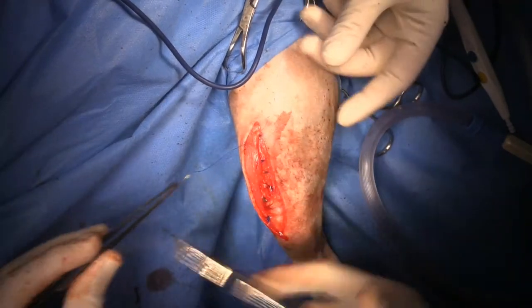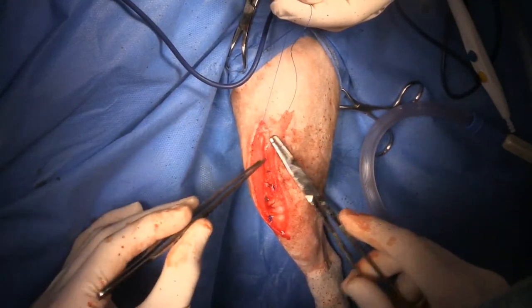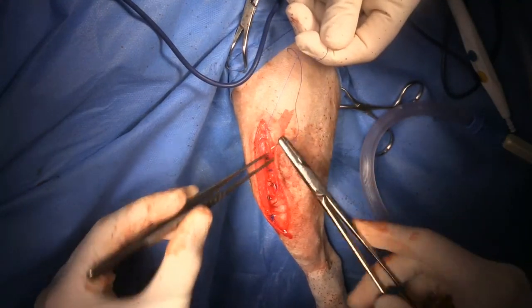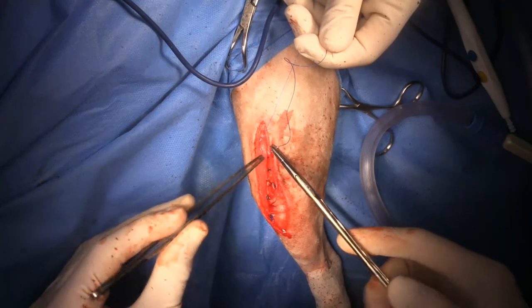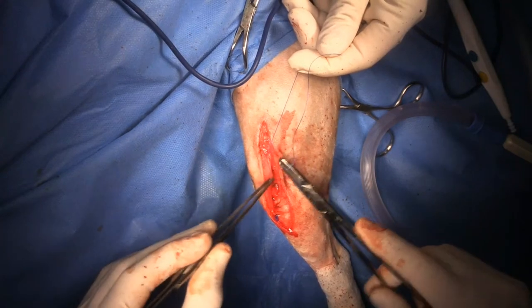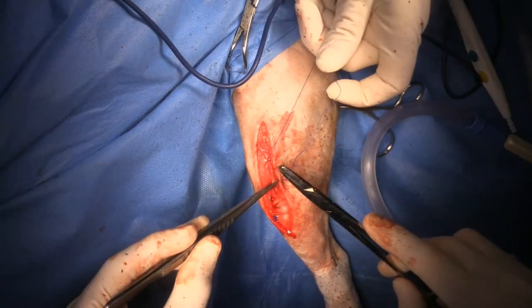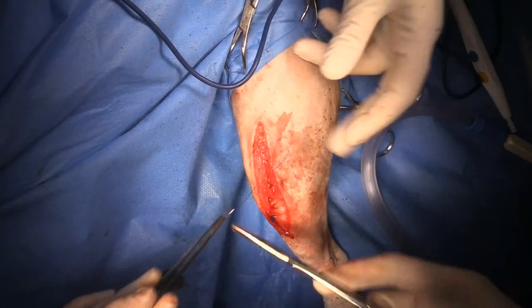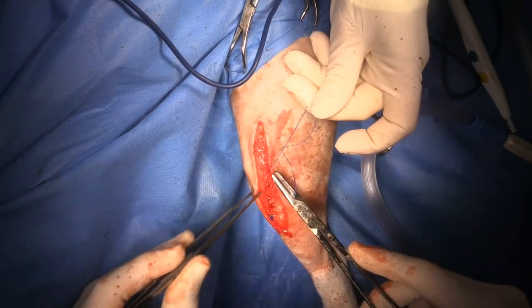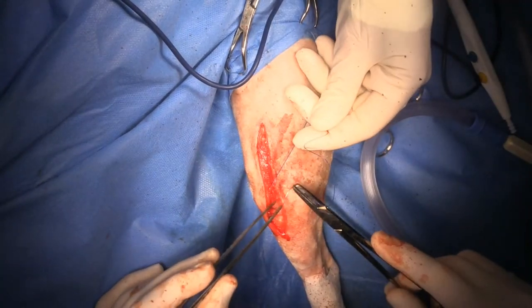This is the sub-Q layer. The fact that we did not do a trochleoplasty on this dog means that it's going to recover a lot more quickly. And I'm making every effort to get as much soft tissue closed over those pins as I can.